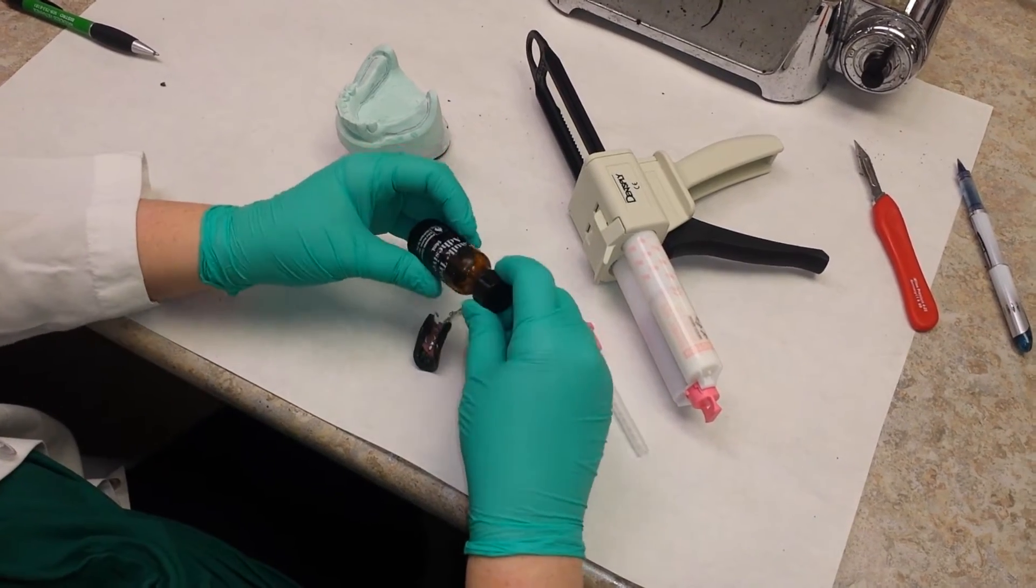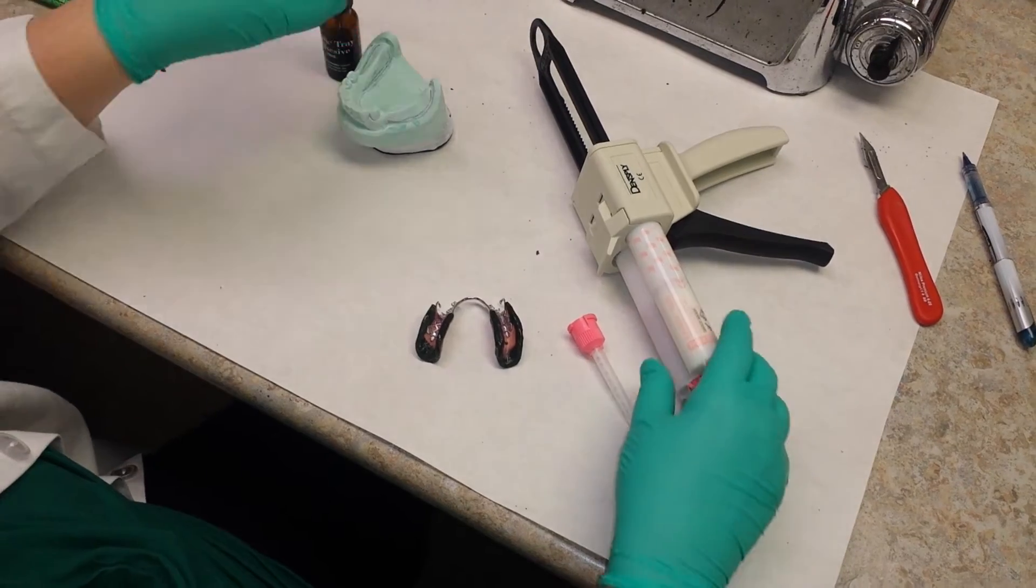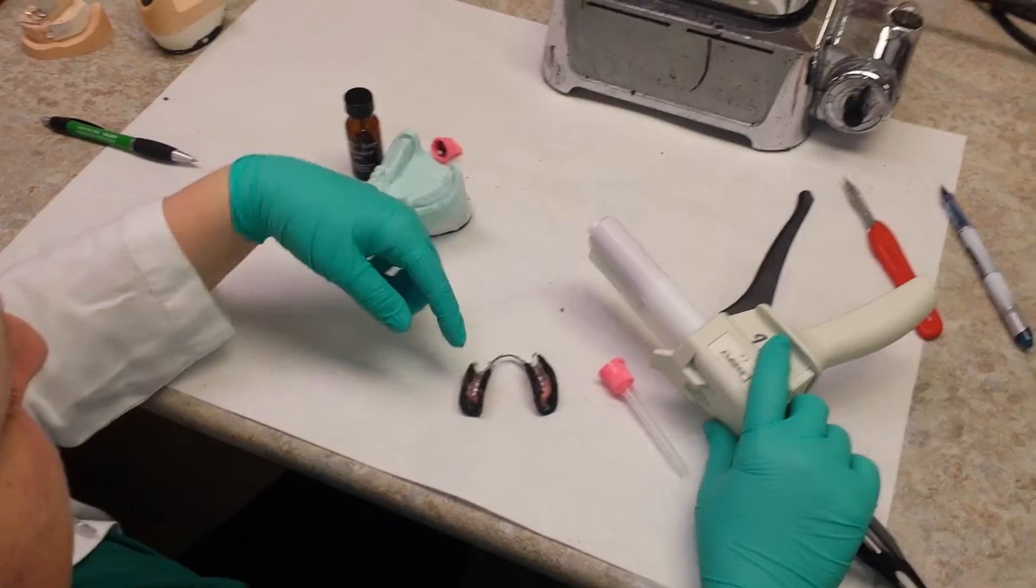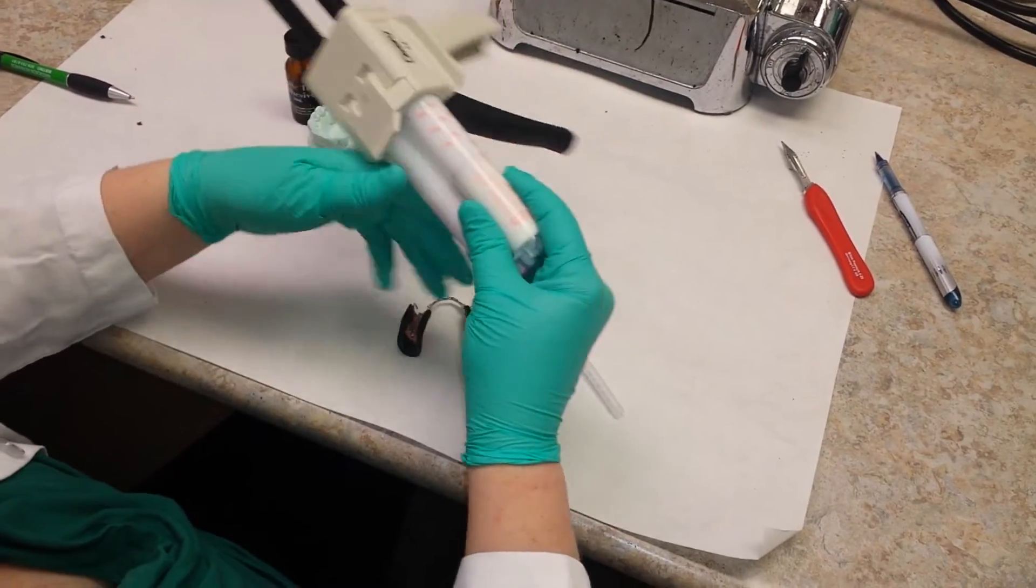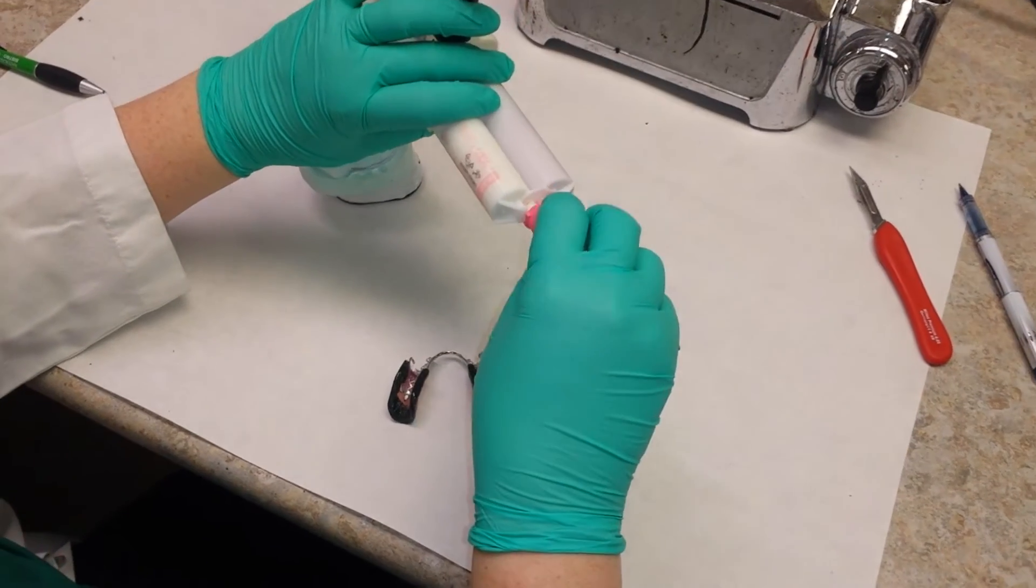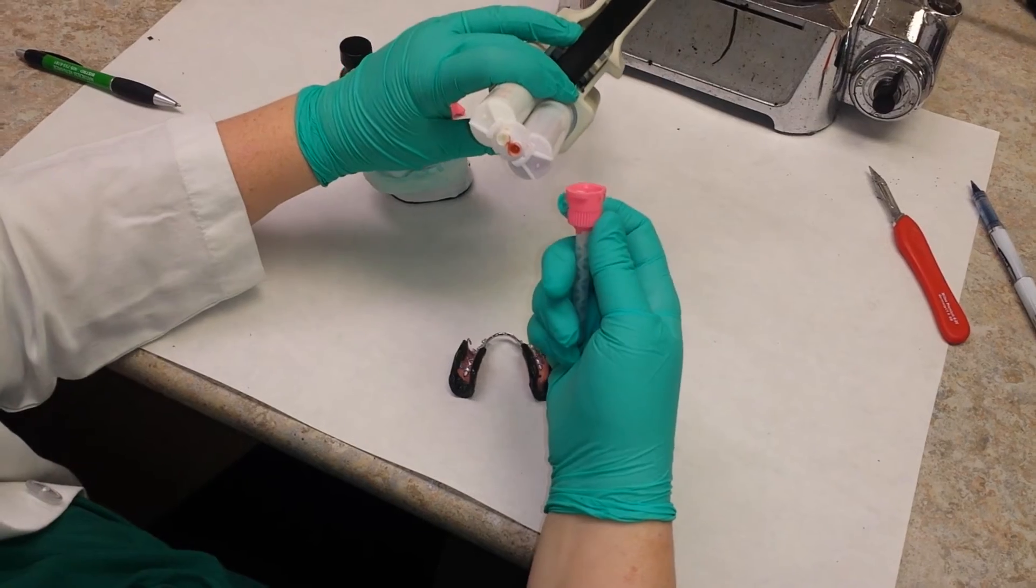Make sure that the adhesive is one that goes with the brand of the impression material that you're using, so you'll get the best adhesion. It's really best to let this sit about five or ten minutes, let it fully dry before using the adhesive, so you're going to get your best adhesion that way.